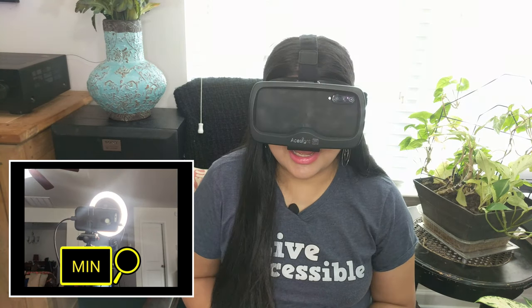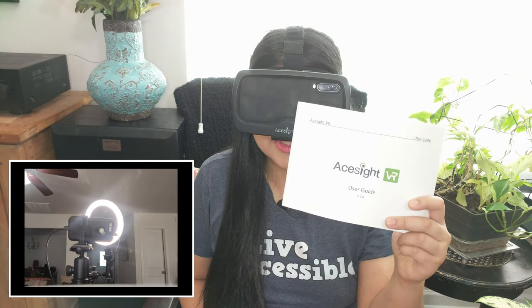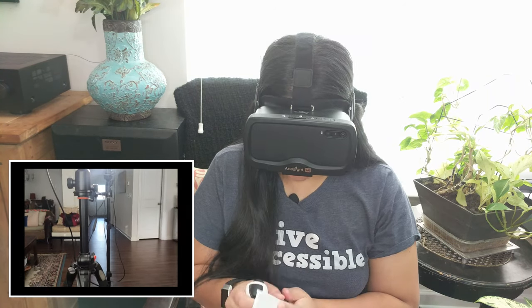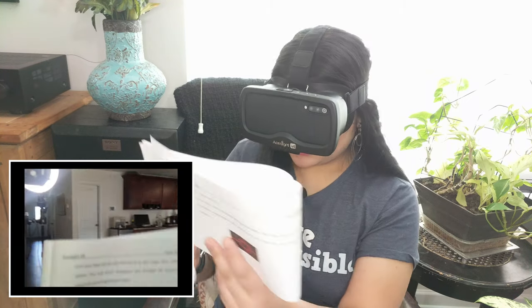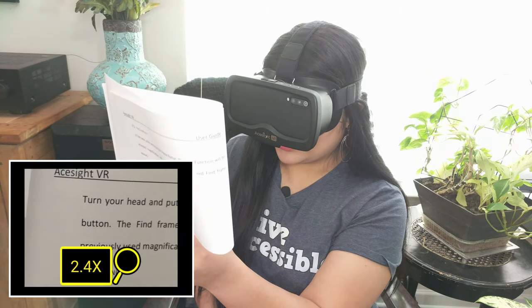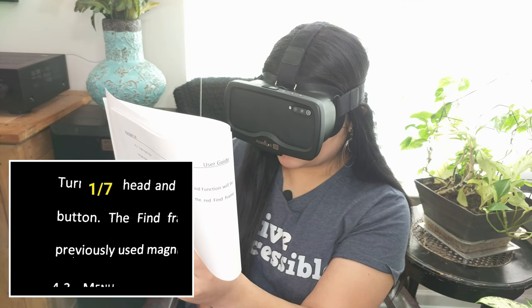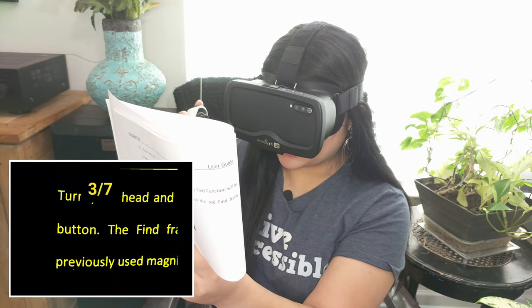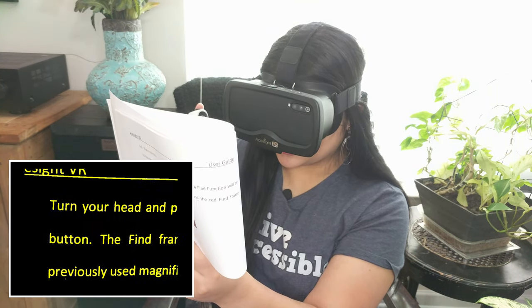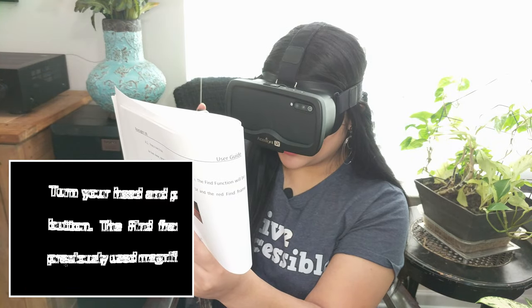And here I have the Acesight VR user guide, and I'm going to open up to a random page, and right here we're going to take a look at it. And here you can zoom in again, and you can press that bottom button on the remote and change the color filters. So it has white on black, black on white, yellow on black, black on yellow.